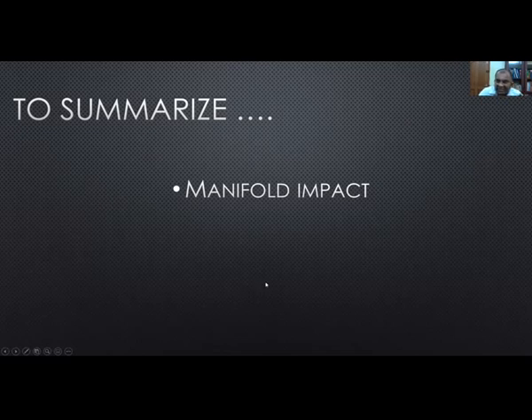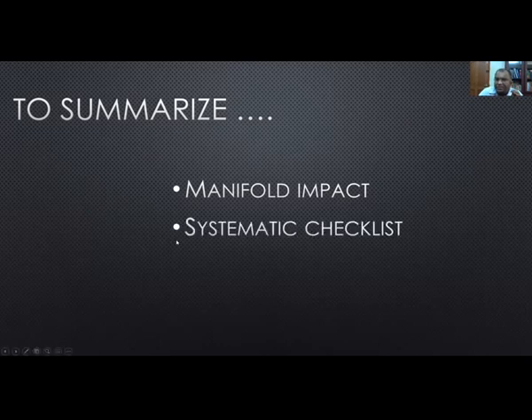And this external aesthetic and cosmetic abnormality puts added pressure on the radiologist in terms of medico-legal litigation and puts us more at risk and gives us a warning. So it is important that we use a systematic checklist. Always document what you are seeing. Always write what you are seeing.